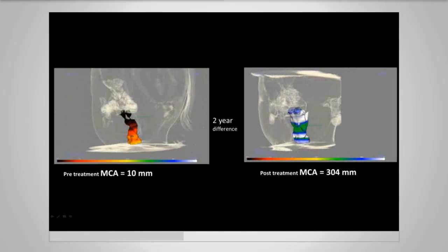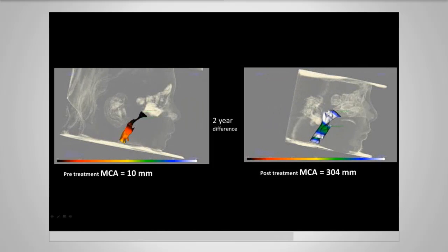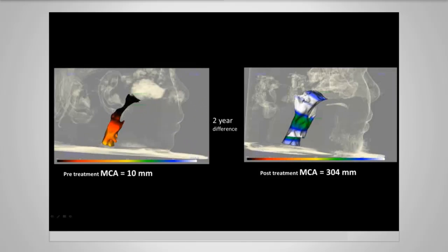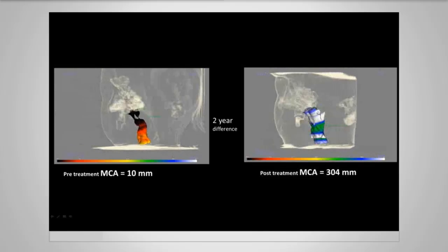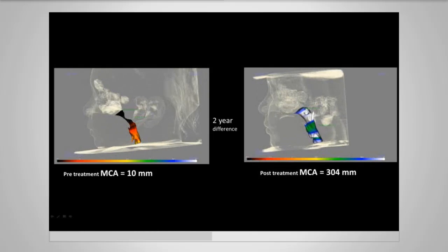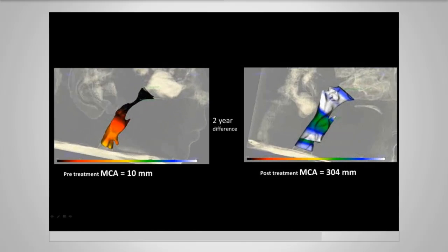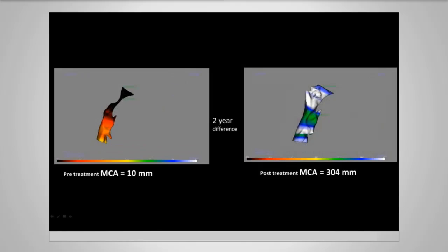If you recall a few slides back, these are the type of changes that we were seeing on orthodontic surgery cases without the surgery on young kids. So how can we not go back and think about airways on children? Again, these are the kind of changes that we're seeing on adult patients undergoing very invasive, very aggressive oral and maxillofacial surgery procedures known as maxillomandibular advancements. So think about how this translates to children. If we can detect problems and screen for kids at risk and perform mechanics that help, anything that helps promote facial growth on children is good for airways.